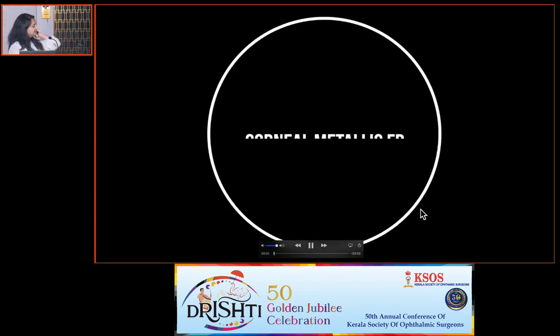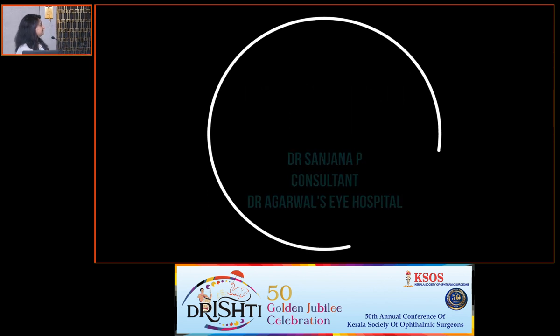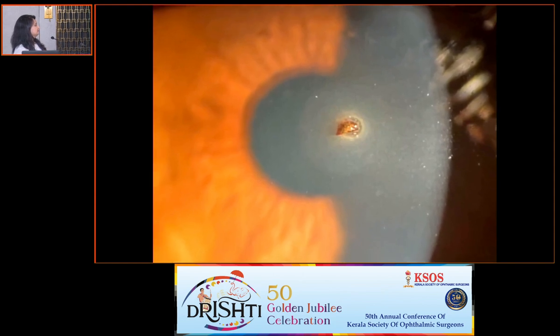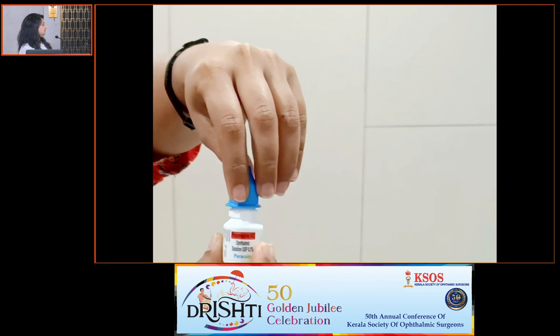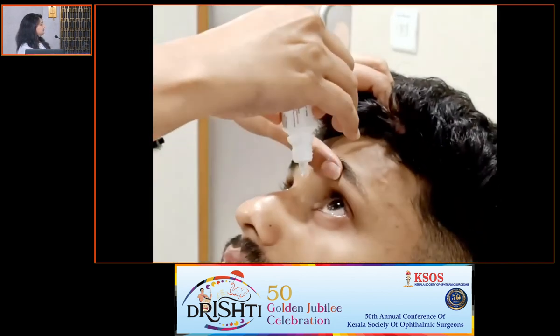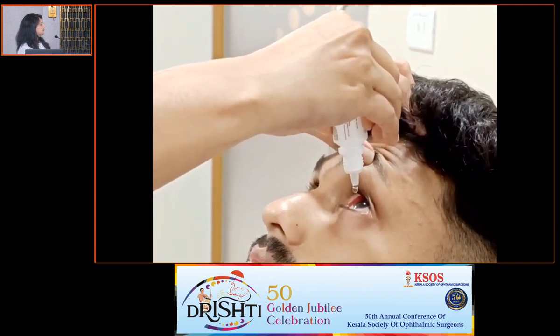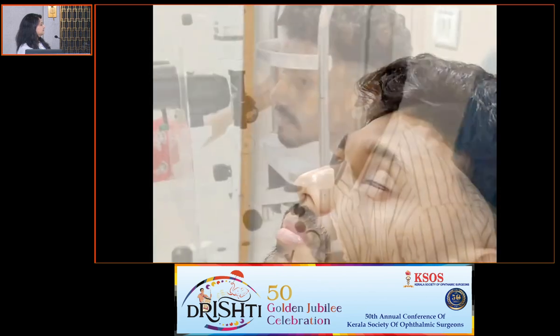In this video today, I shall be discussing how to remove a metallic corneal foreign body. Most of the time, these are patients who come following a welding work with complaints of pain, redness and foreign body sensation. So the first and foremost thing is to instill a Paracaine eye drop so that the patient is pain free. After which, the patient has to be placed over the slit lamp for evaluation.